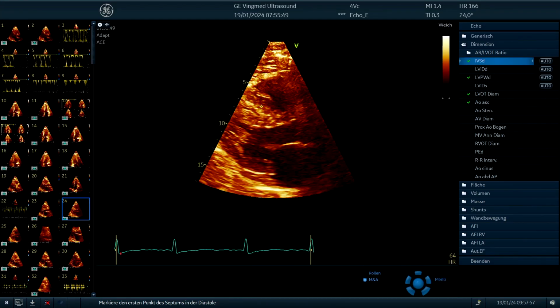I think those are right ventricular structures. I would measure probably here, where you have really a thick septum, and it's in the range of, I would say, 22, 23, 24 millimeters, which was also what we got on the MRI. So here we have a limitation in our measurements, because it's simply harder to see and harder to differentiate, because the patient was not easy to scan.